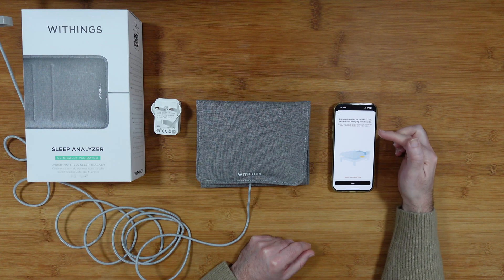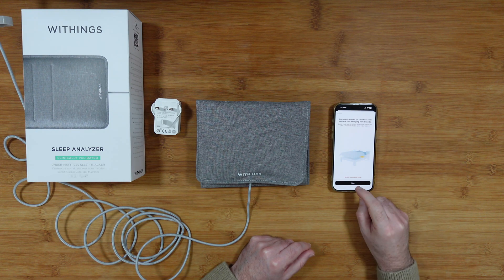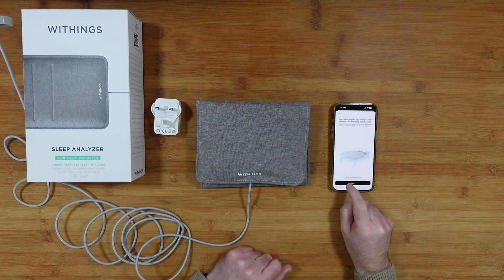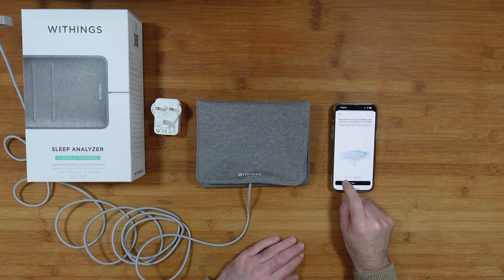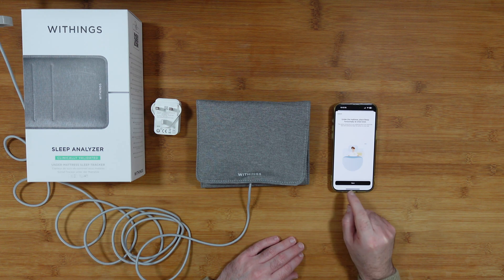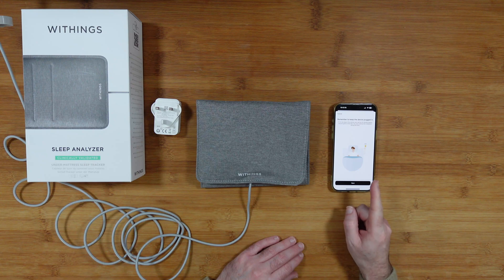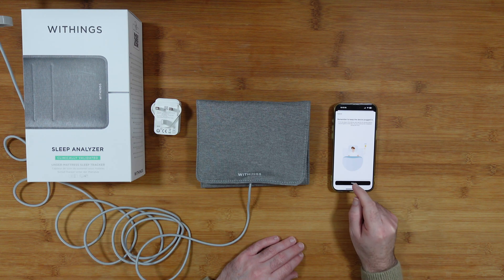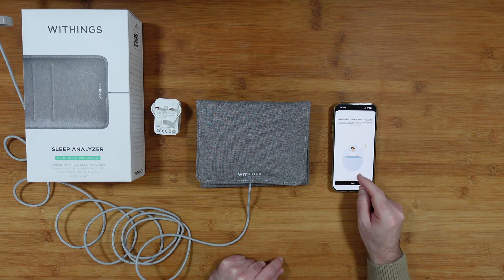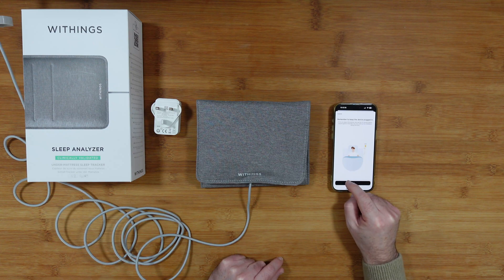The app says: 'Place the device under your mattress with the cord emerging from the side.' If you use a slatted frame, you'll need to place something on top of the slats for it to sit on. Place the sensor horizontally at chest level. Remember to keep the device plugged in and wait 10 minutes before going to bed if you unplug it during the day. You can continue installation during this time.